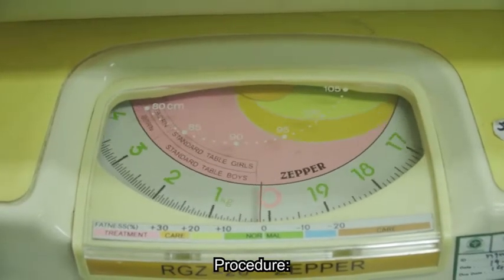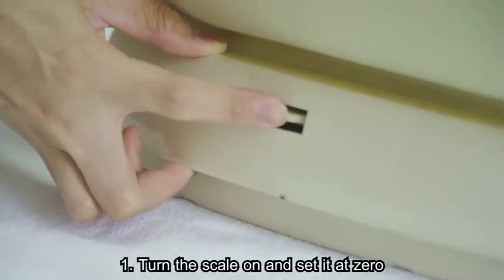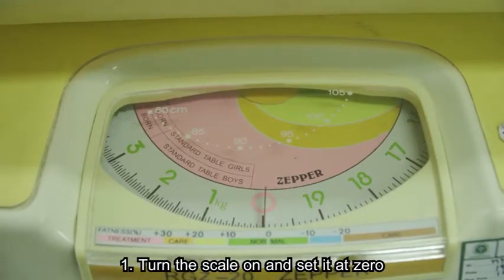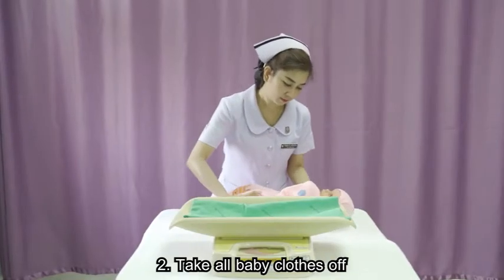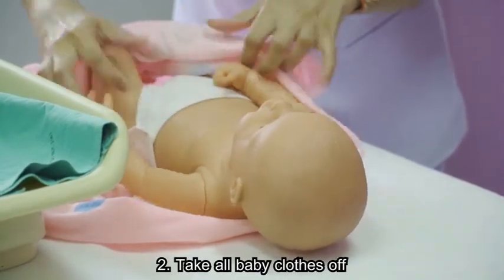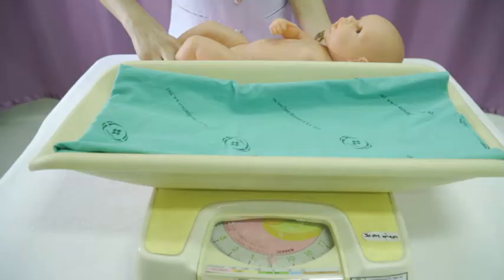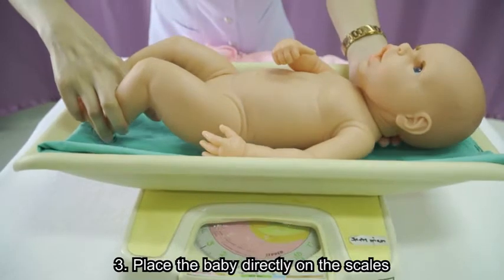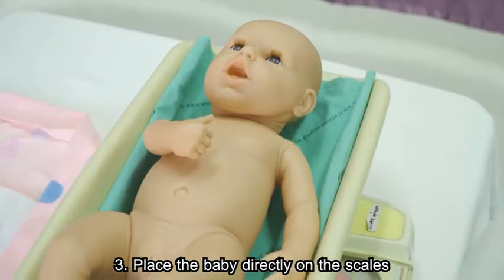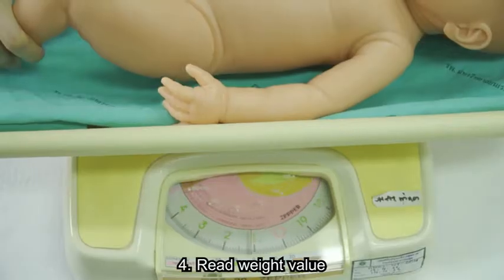Procedure. Firstly, turn the scale on and set it at 0. Secondly, take all baby clothes off. Thirdly, place the baby directly on the scales. And finally, read the weight value.